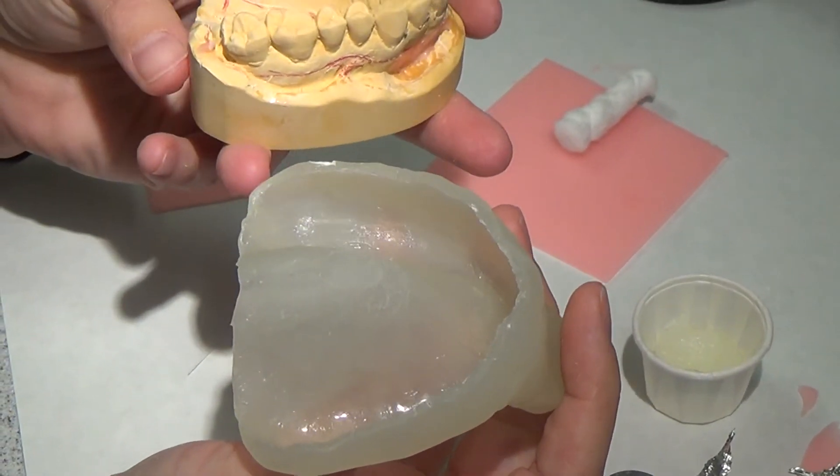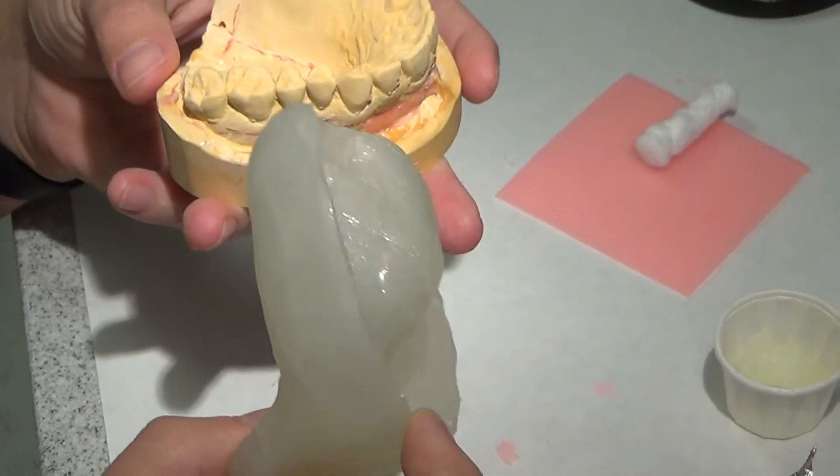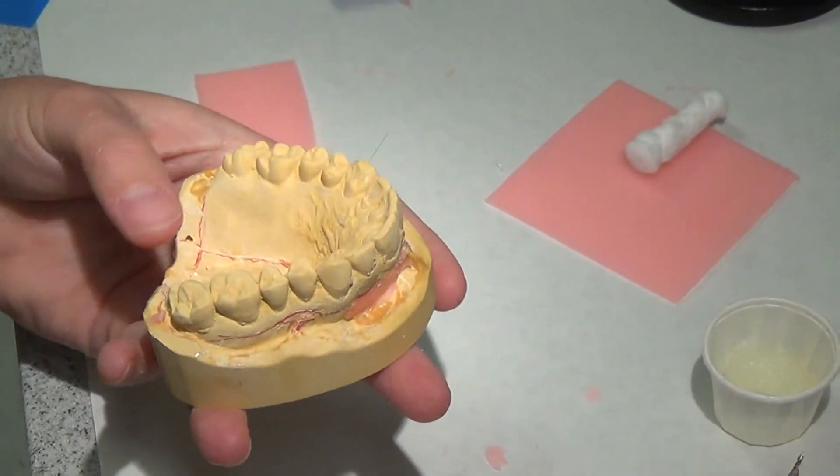Do you all want me to do the mandible, or does this make enough sense? I'm happy to do the mandible.